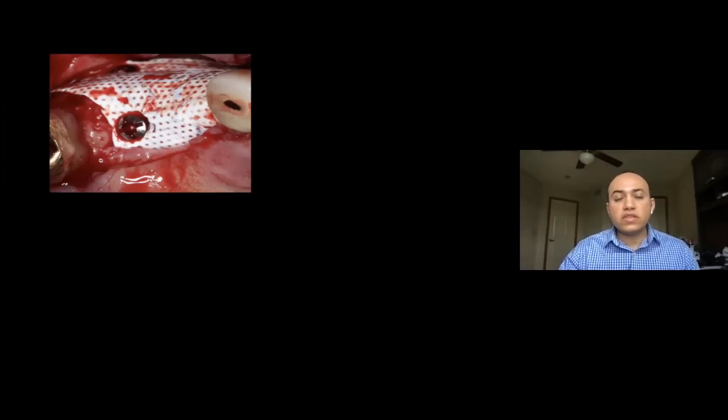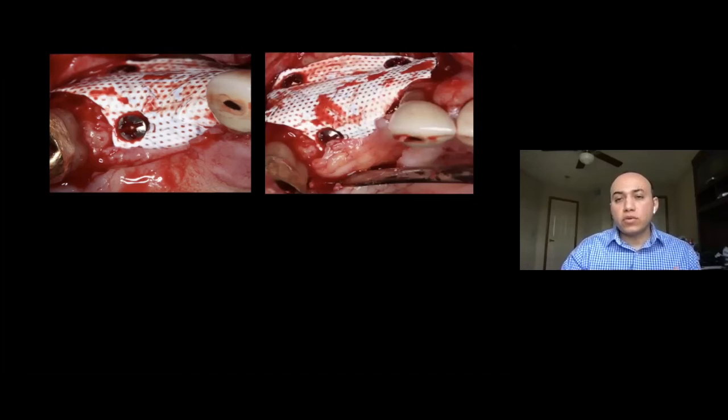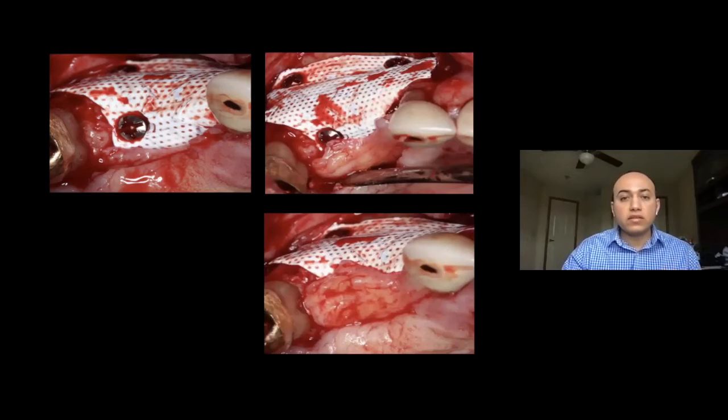And then because, as I told you, the cytoplast, as good as it is and as nice as I like it, the problem with the cytoplast is that if it gets exposed, the flap will start sliding. So to protect that, I wanted to get a palatal pedicle graft to cover the suture line. This is a partially dissected palatal pedicle that's still attached to the palate, and that will go over the top part of the membrane.